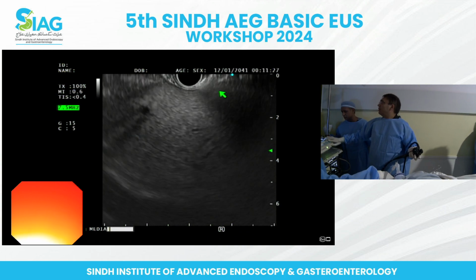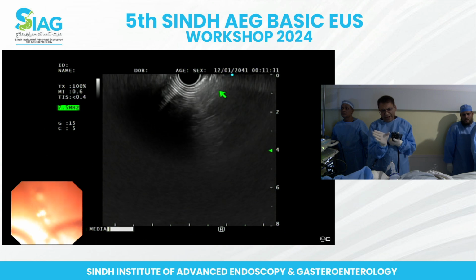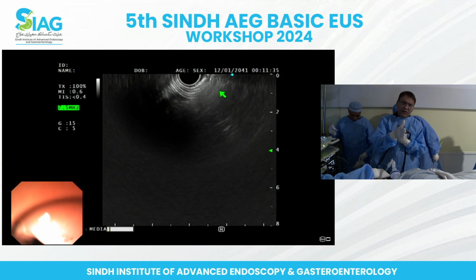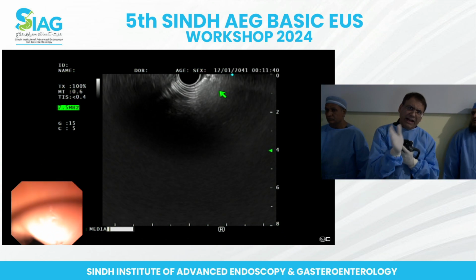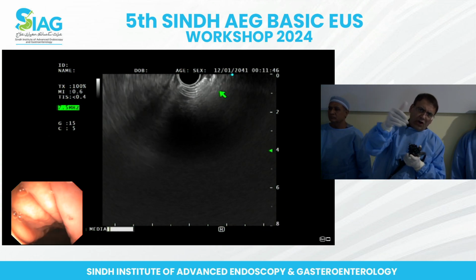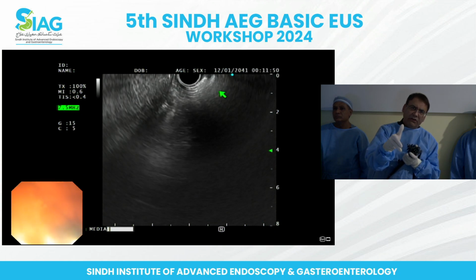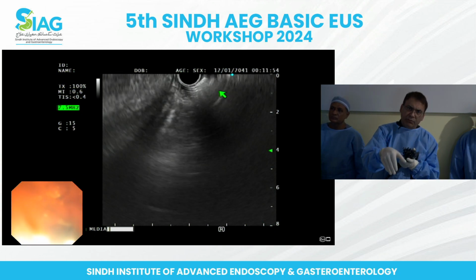So I'll try to show the liver segments in there. As everybody knows, there are 8 different segments. First of all, there's a right liver and left liver. The right is right anterior and right posterior, and then the left lobe. The left lobe has the caudate lobe, and then there's segment 2, 3, 4. And 2/3 of the liver is on the right side, right anterior, right posterior.